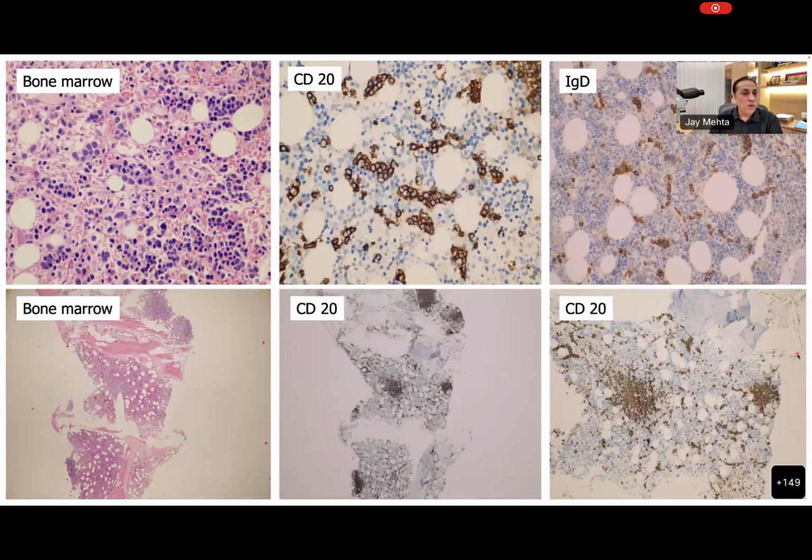Now, this is the bone marrow of a splenic marginal zone lymphoma. This is an unrelated case, but what I want to highlight here is the lymphoid cells in the sinuses. This is a high power, of course. We can see CD20 beautifully, see the cells coursing through the sinusoids. IgD is also highlighting the same. This is very characteristic intrasinusoidal localization of splenic marginal zone lymphoma.